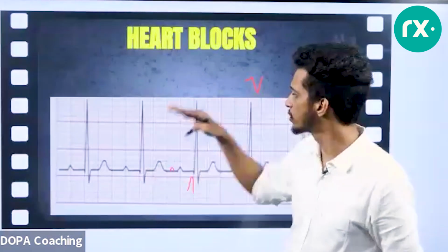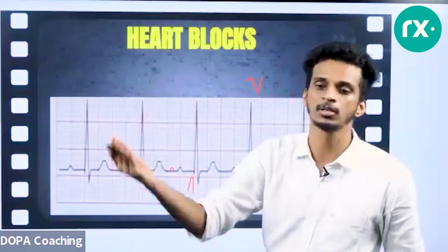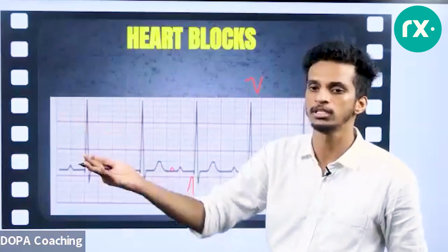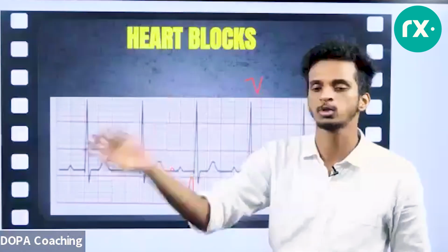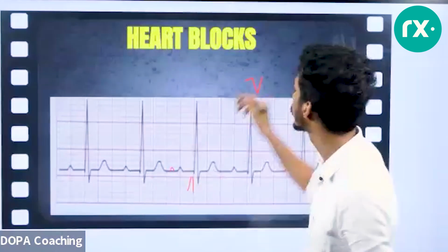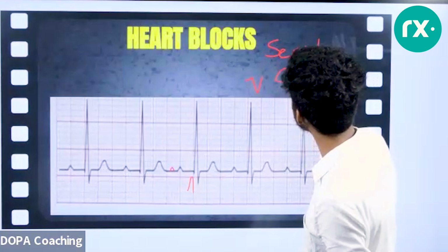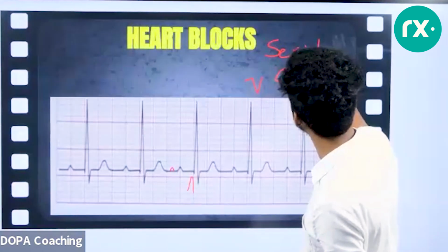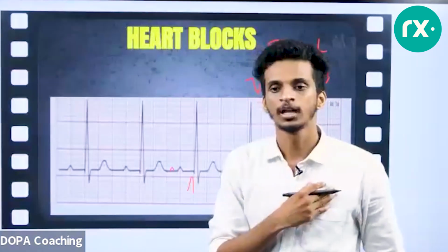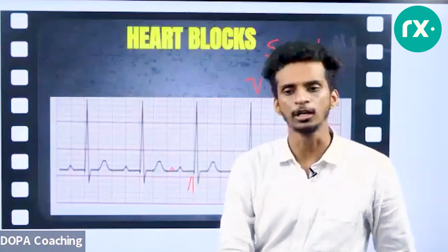If we see some elevations or depressions, some NSTEMI or STEMI changes, we can ask for their old ECG. If their old ECG is also showing those changes, that is not significant because there is no serial change. Serial changes are always important. For example, I took an ECG now, and there is a mild ST depression, let's say in lead V2.